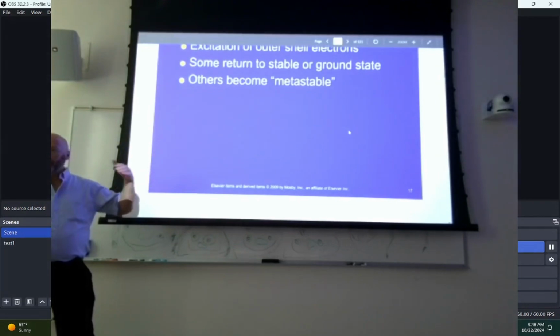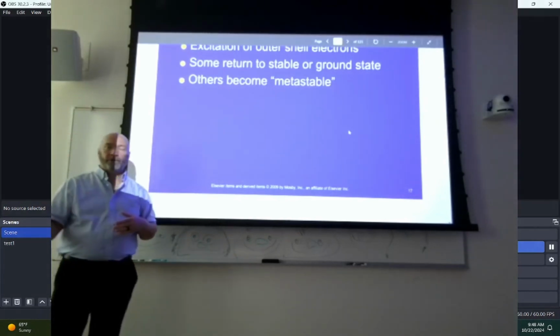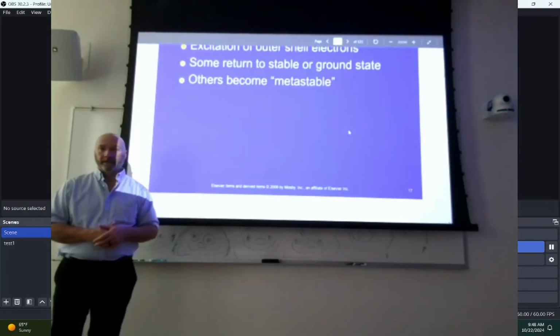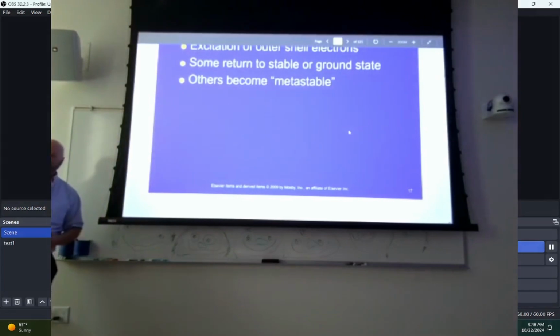With that metastability, as soon as you make the exposure, that's as good as the exposure is going to be. And if it takes you 2 hours to get back down to process that image, it starts to lose that metastability and the image starts to degrade. To the point that if you don't process the image within, I think it's 8 hours, that image is garbage, unusable completely. Okay. So metastability doesn't mean that it's a better level of stability. It just means that you've got something that's held on some sort of extra energy that it's holding on to. It's stable, but it's not at its most stable state.